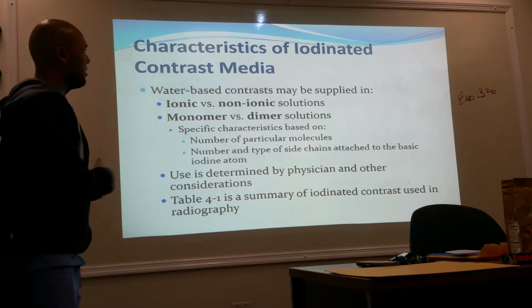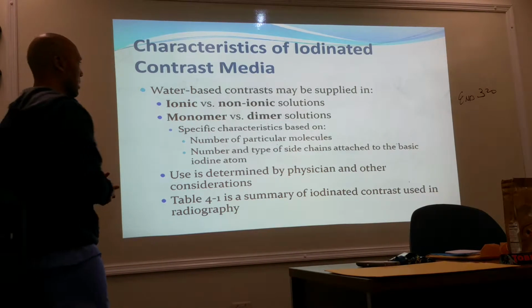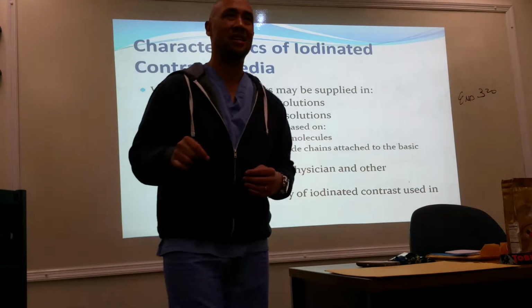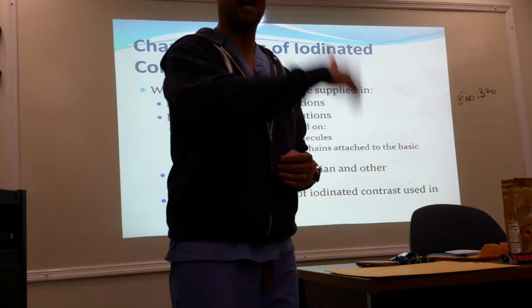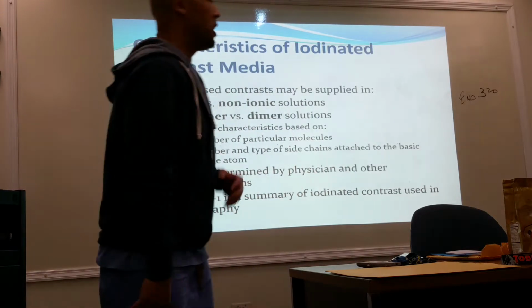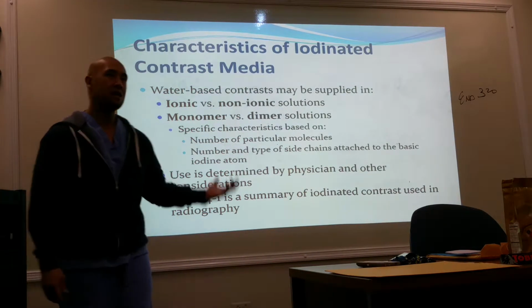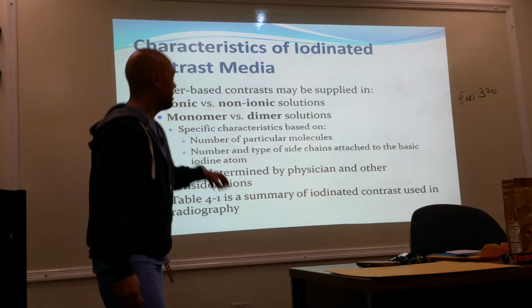So the water-based contrast may be supplied in either ionic or non-ionic. The word that I introduced to you guys earlier was iodinated, meaning it has iodine. Do not confuse that with this next term, which means ionic and non-ionic. What does this refer to?